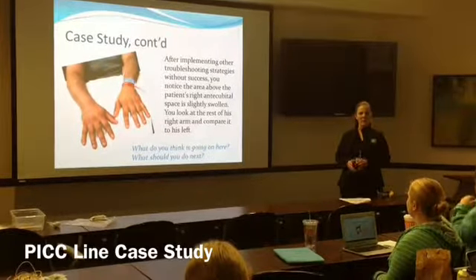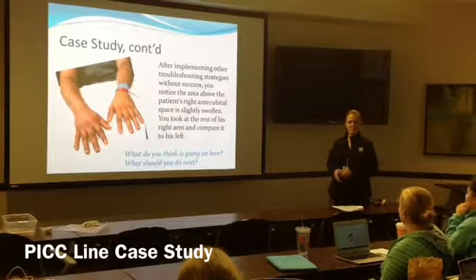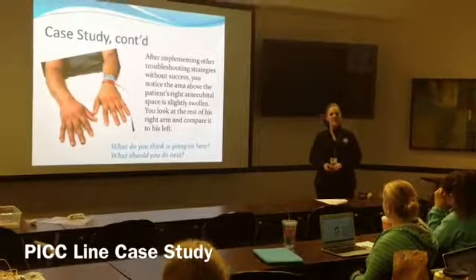Why would we want to do the contralateral side? Yeah, I'm not going to put it in the same place if we have a clot that's going on. All right. Very good. Do you have any questions?